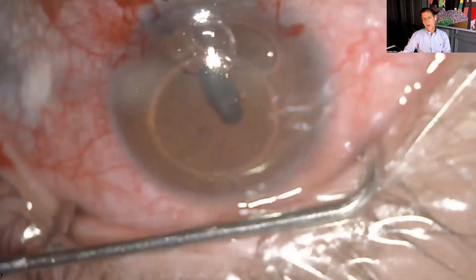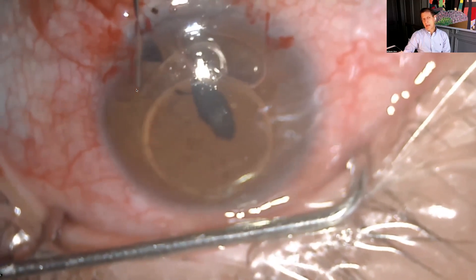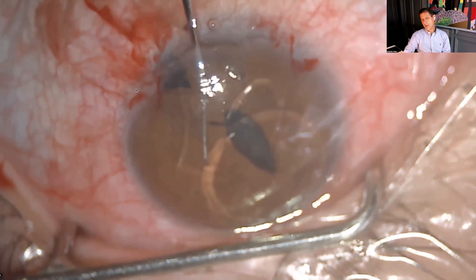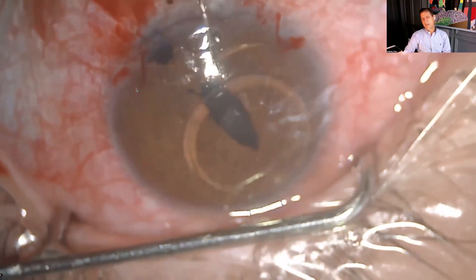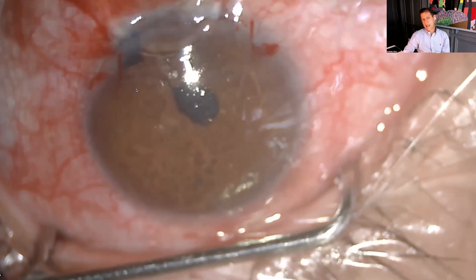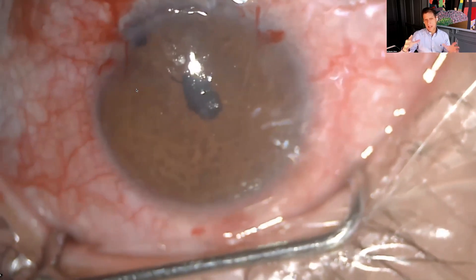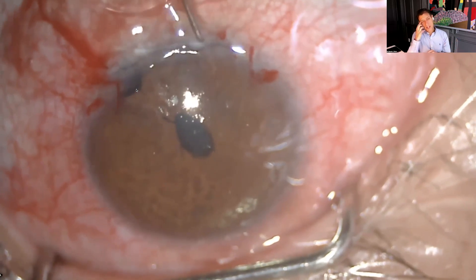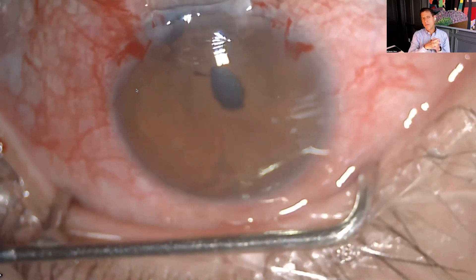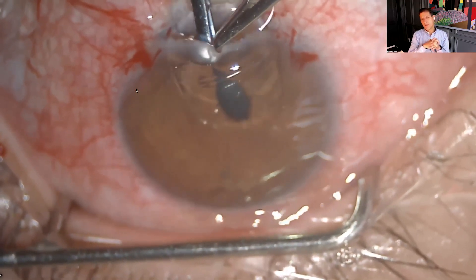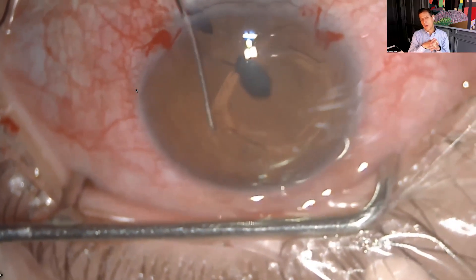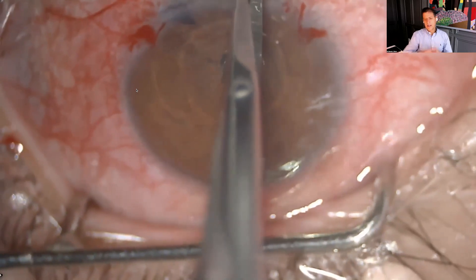The Baikoff haptic is PMMA so you can remove it; it was behind the iridectomy. If the anterior chamber is small and the white-to-white distance is short, the haptics may get entangled in the iris — a good option then is to cut the haptics with scissors before explanting the lens. The lens is then replaced with an Artisan aphakia lens, which we'll discuss next.